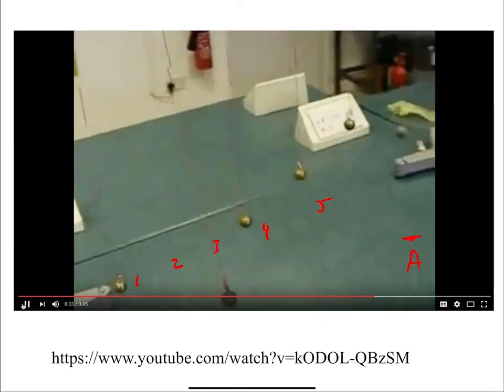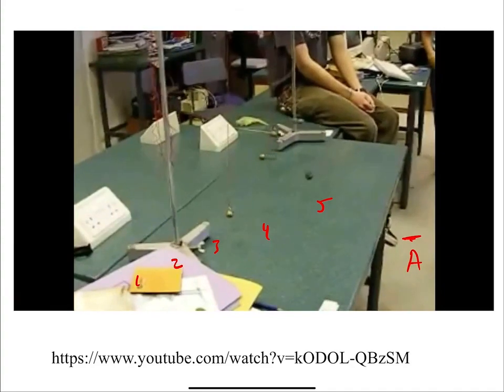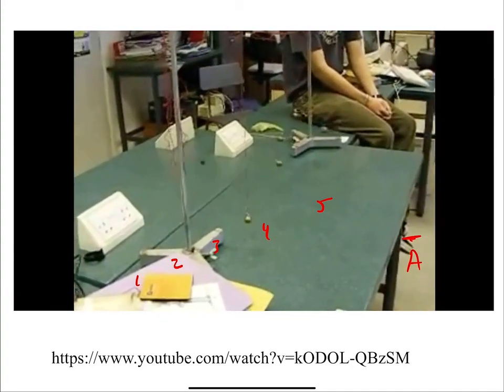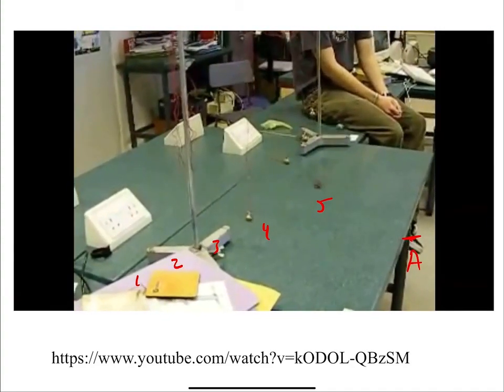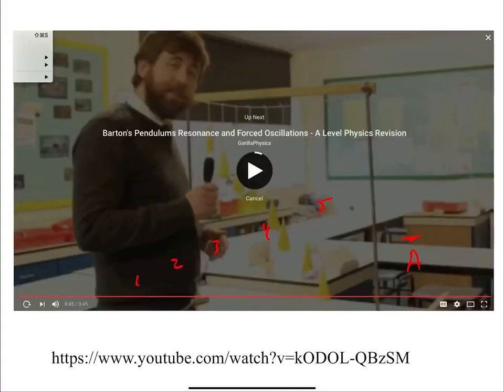So 2 has a go to the side. 2 is actually the same length as the exciting ball, so it was sort of a trick question. But that's at the resonant frequency: you excite those spins at the resonant frequency. All the other spins are off resonant, so they're not going to get excited. So that's the basic idea behind slice selection, which we'll pick up again on Monday. And now we'll turn it over to Professor McVeigh to talk about quiz 1.